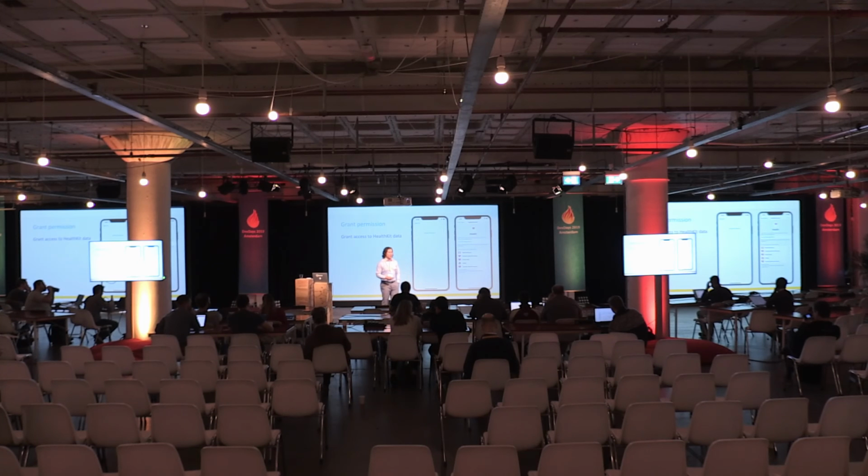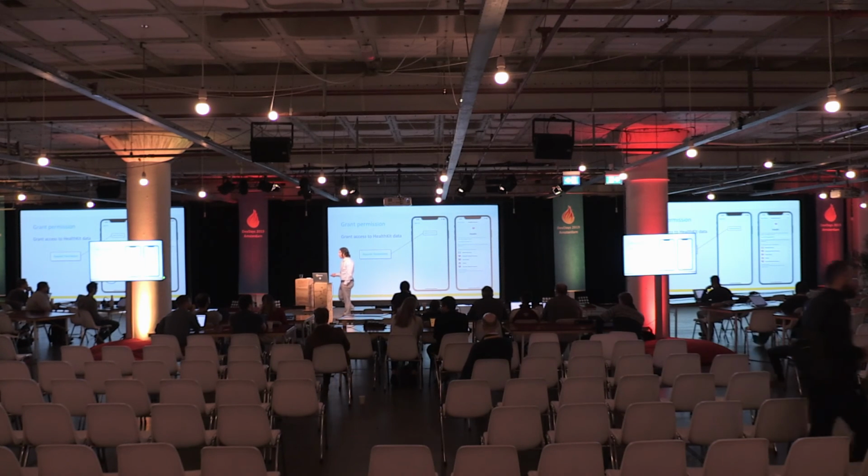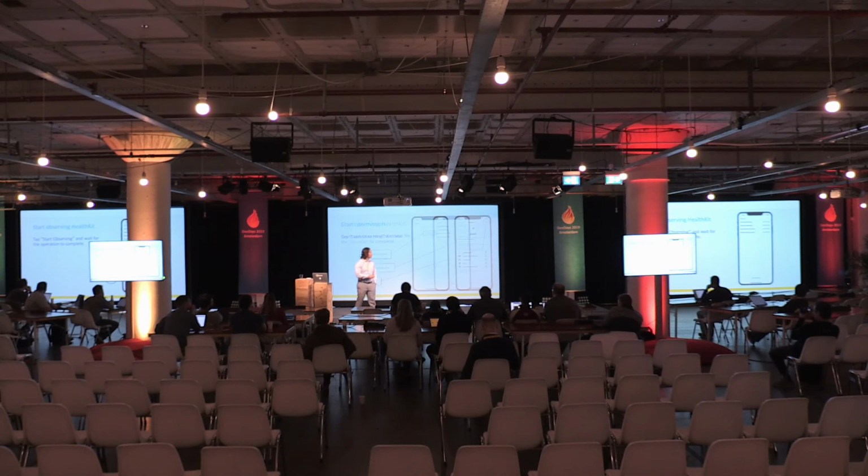And then here's where we're going to ask HealthKit for permission to access user health data. So we're going to tap the Request Permissions button. And then you want to turn all categories on. So this is going to flip all of these switches to green, and then hit Allow. And so this will allow us to access all the data in the HealthKit on the iOS simulator. Okay. So after that's done, we just start observing.